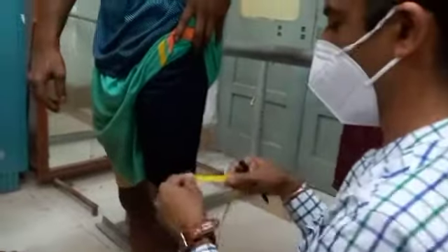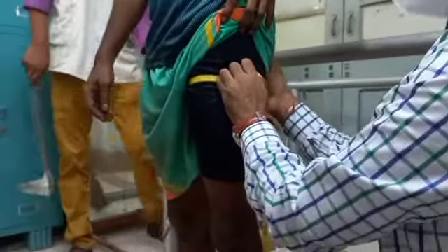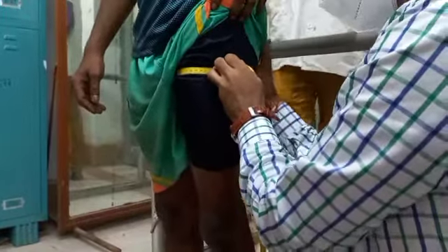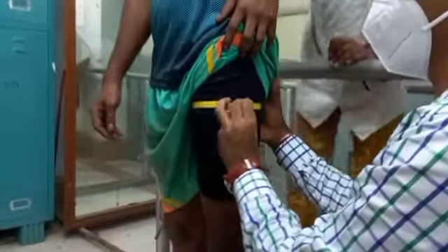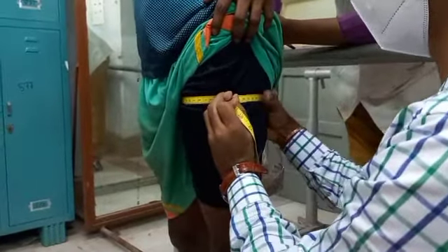So we think that this is our liner. Over the liner we are going to take the measurements. For the first measurement, I will first find the lowest point and draw a horizontal line, right? I am putting this scale at the lowest point. If I don't have that outside caliper, then also I can do this. Because this is cloth, there is a chance of some change.